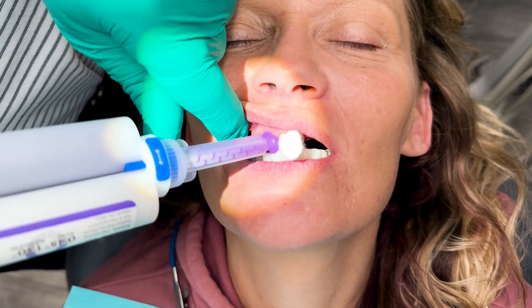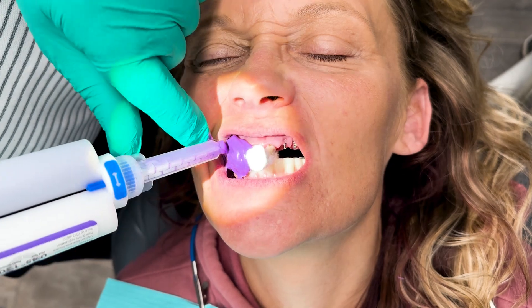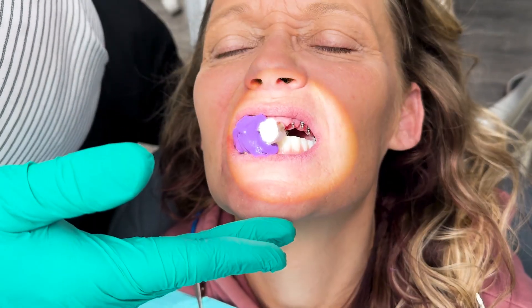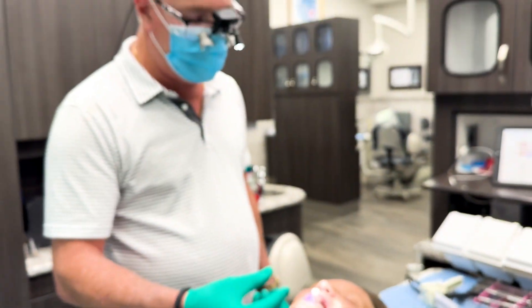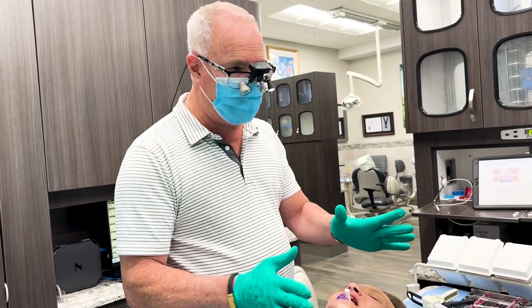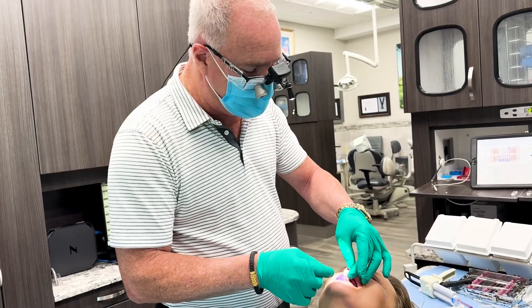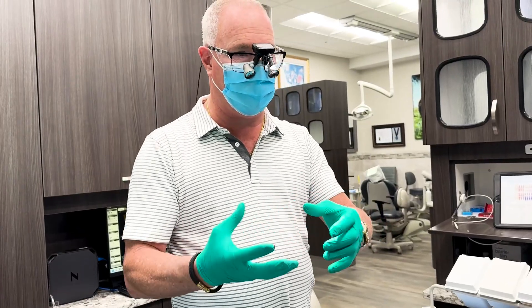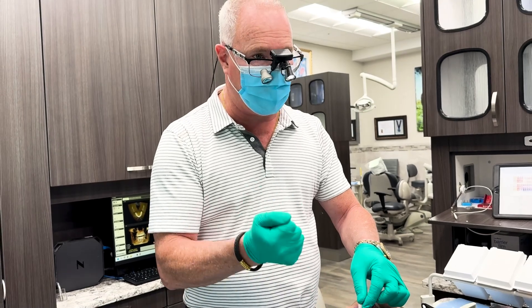Okay, we're going to do one side — hold it right there. Another 30 seconds. Once this side's done, I'll take the cotton roll out and we'll take the opposite side bite. This is just one way of doing things. Everybody has their own way, but this has worked for me very well over the years. It helps them to stabilize, because sometimes when they bite on their own and don't have something to bite on, the jaw moves around. This way they're biting on the cotton and holding it real still.